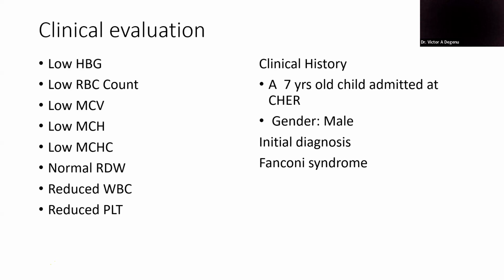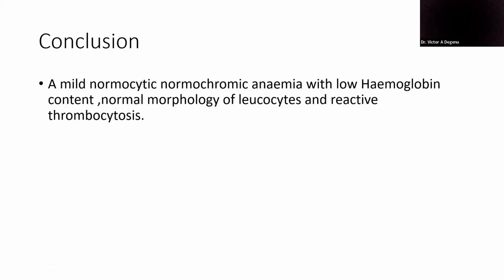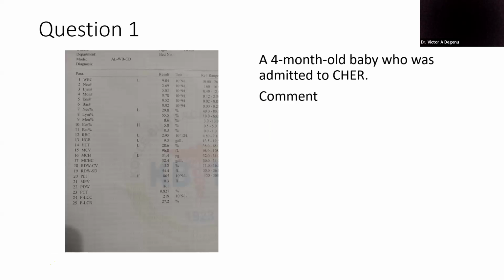We look at our result produced by the machine, and we try as much as possible to deduce the possible cause of illness from the report that we have before us. And we have gone to the extent of making an assumption that plays well into clinical history, as to whether what we assume is correct or not.